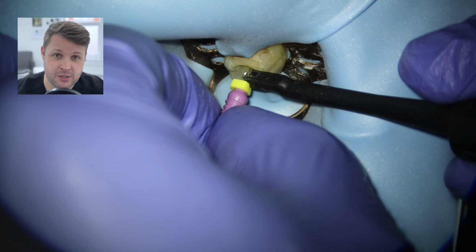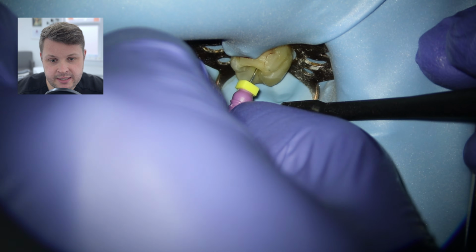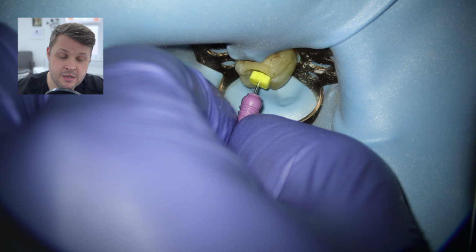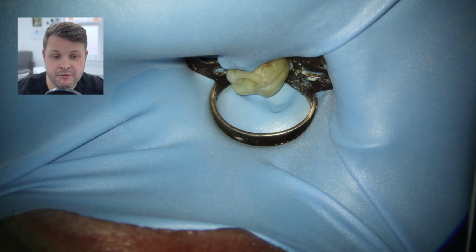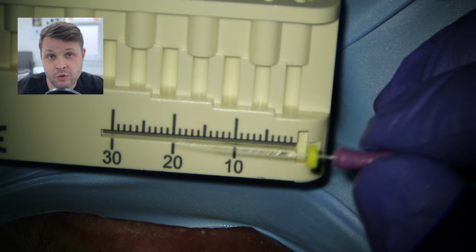We place the apex locator on this file, and we find that again we're not getting that 0 reading, and obviously I'm going to just place the rubber stopper as far as we can get, pull the file out. We then measure how far we've got. In this case it's 20.5, and then we're going to just do the same protocol as before.